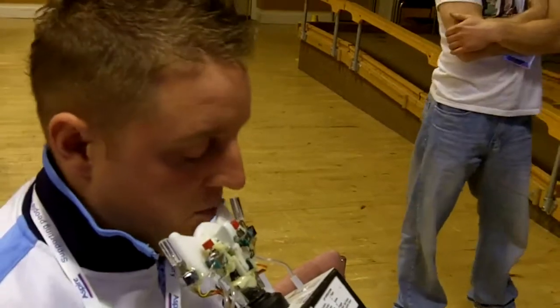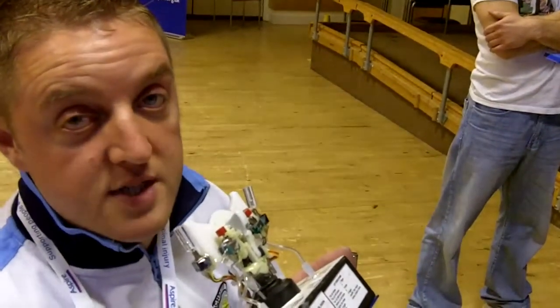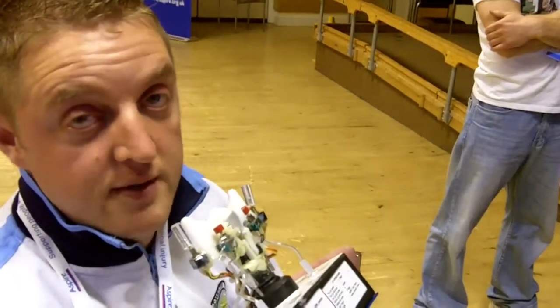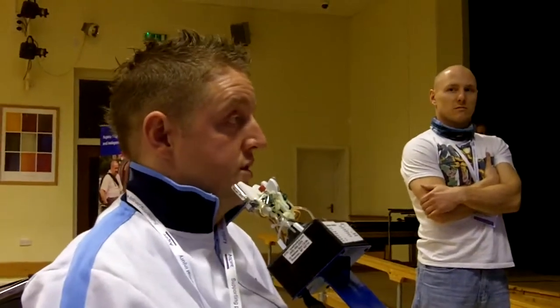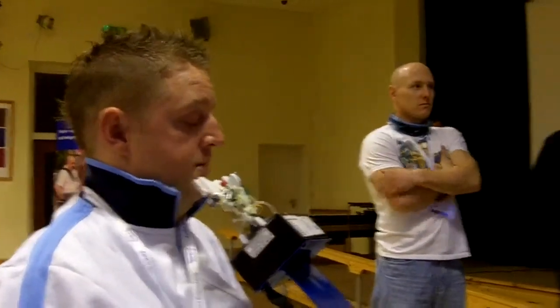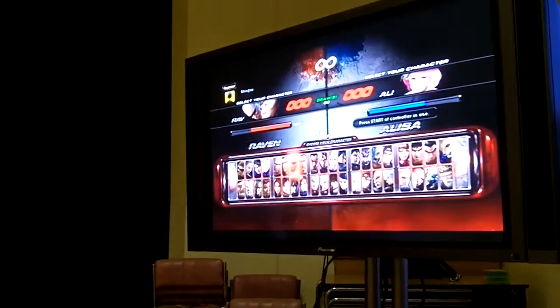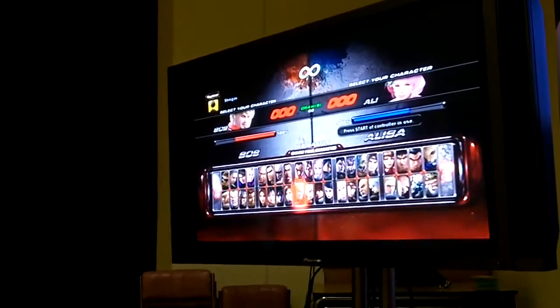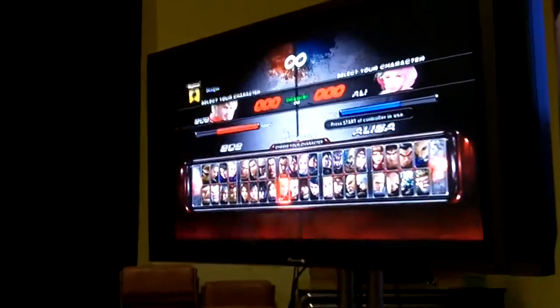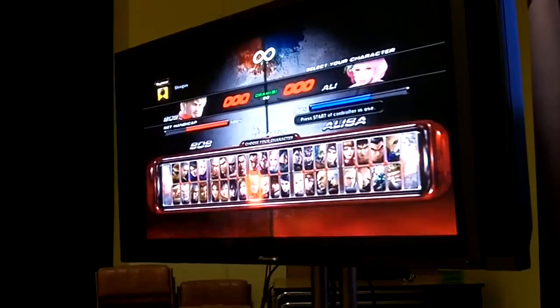To move left and right, I utilise that device, but it's much easier to see it in action than to talk through it. My favourite game is Tekken, so that's what we're going to utilise here. Look at the screen on the computer. I'm able, by moving my chin, to select left, down. My favourite player is Big Bob, and then I use the button switch on the lip to select.